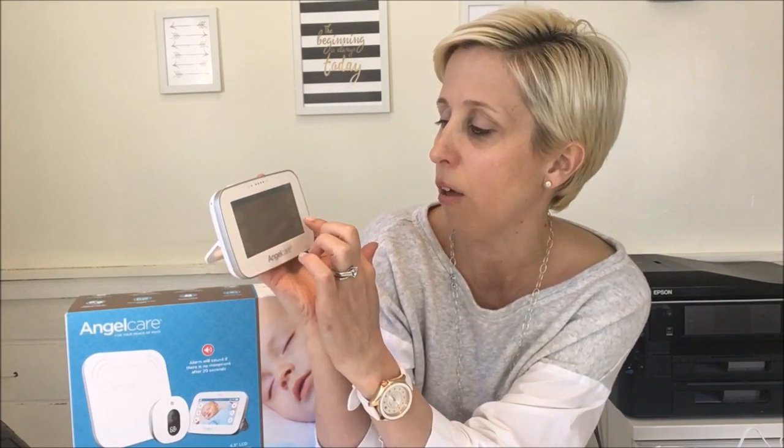Some other great things about this monitor: it does have a color-changing room temperature display on the touch screen parent unit. You just touch it — there's a main menu for settings with volume, pan, zoom, and more. You go into settings and set your temperature threshold. The unit turns blue if it's too cold according to your settings, and red if it's too hot, so you can easily see that baby is comfortable.